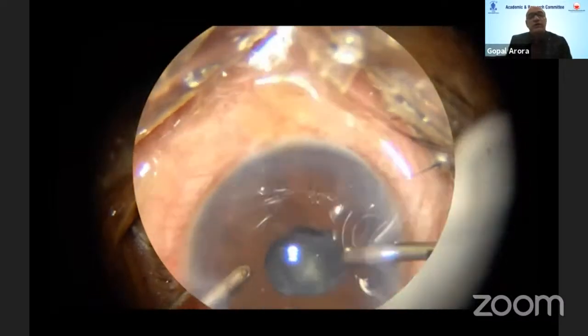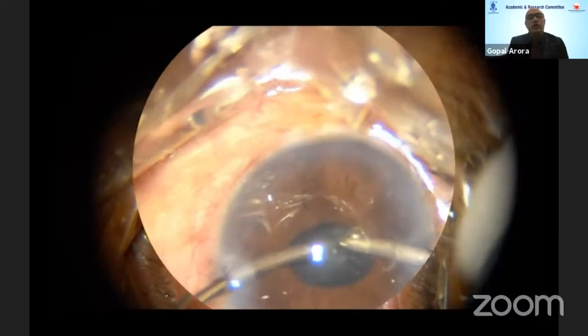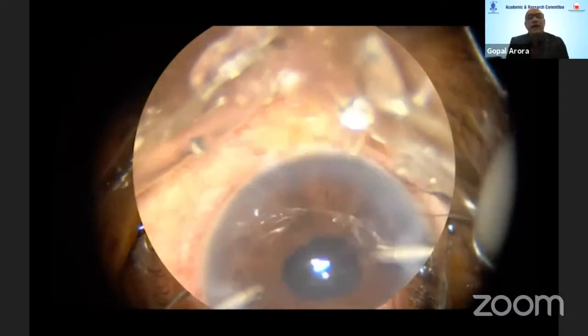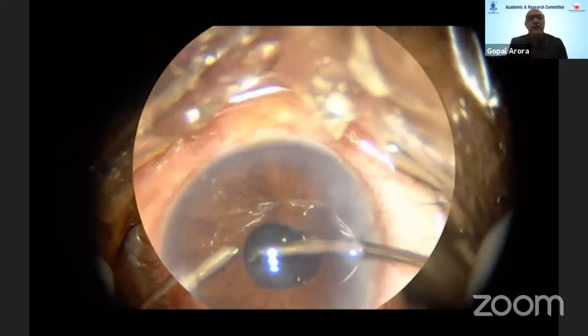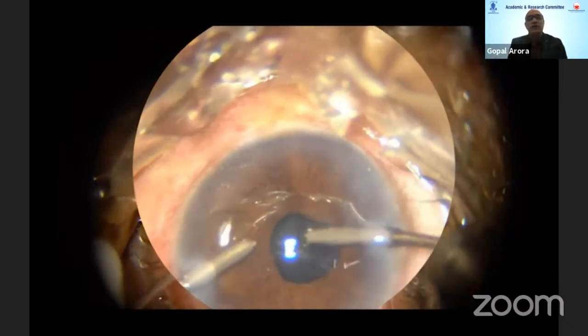Here you need to be really patient when you're doing the epinucleus or the cortical matter washout, because it is this area where you actually can catch hold of the iris margins. And this is basically intentional, which I have not done the editing here, because as you can see, I'm holding the iris margins. You need to be really careful.